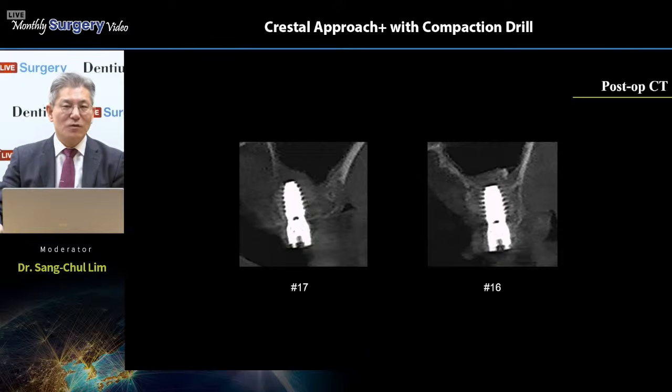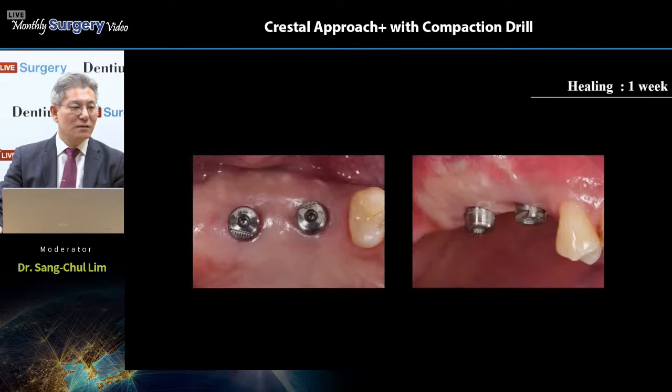Osteogen comes from bovine, however collected from a cancellous bone source. So at first, not so big a radiopaque situation. However, after time, these areas will be more radiopaque because of newly forming bone. Okay, so you can see 3 months after, a more radiopaque situation on this site.